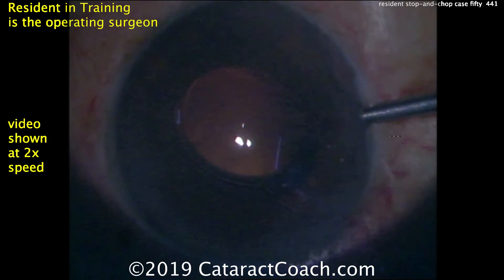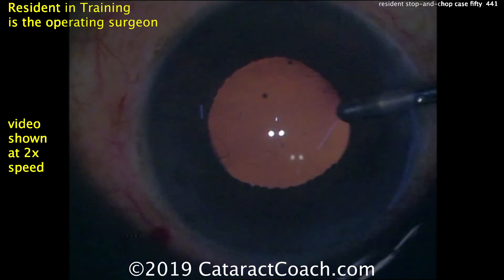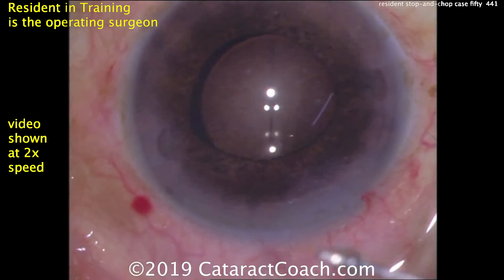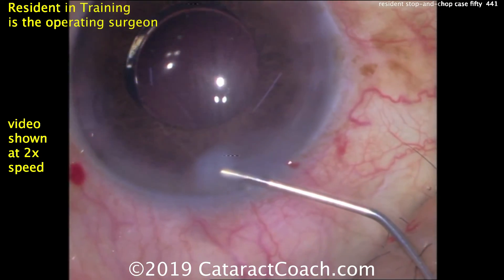To fix the haptic above the iris, you want to have the infusion in the eye because that keeps it inflated — and there you go, just dial it in. Alternatively, you could use a second instrument while the infusion is in the right hand. Since the lens was inserted with just infusion of balanced salt solution, there's no more viscoelastic to remove, and everything looks good.